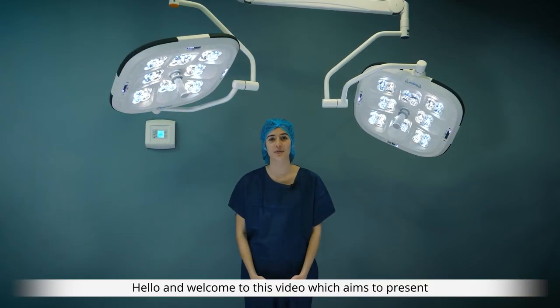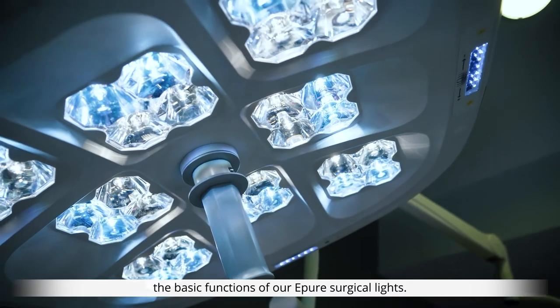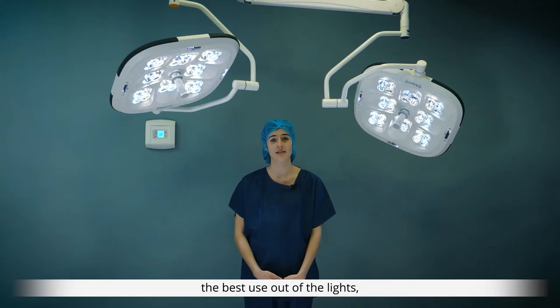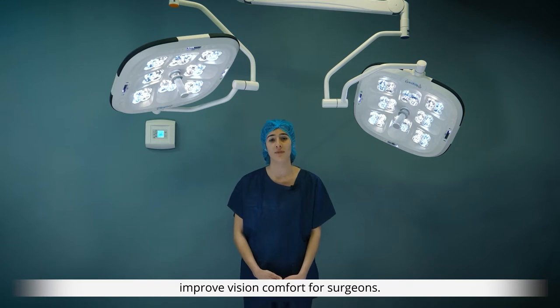Hello and welcome to this video which aims to present the basic functions of our ePure surgical lights. This video will allow you to get to know the best use of our lights, discover its entire performance range and therefore improve vision comfort for surgeons.